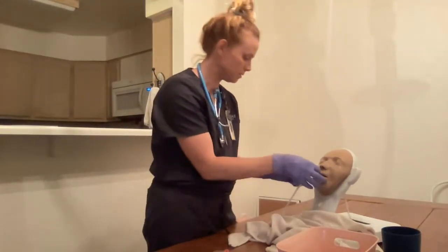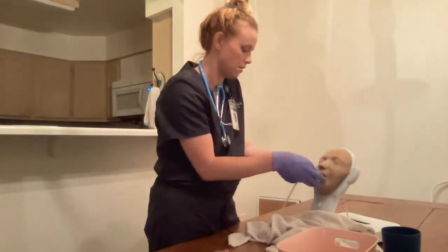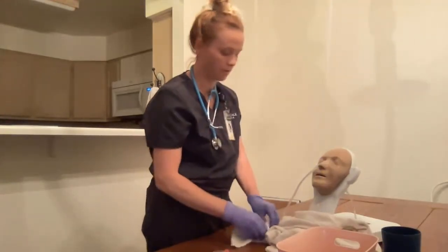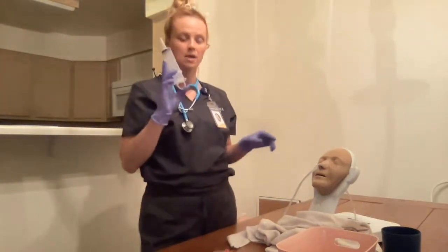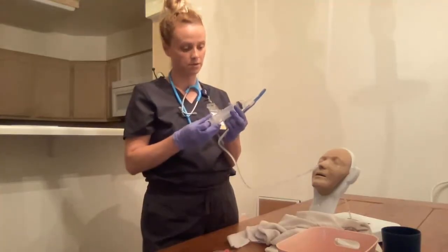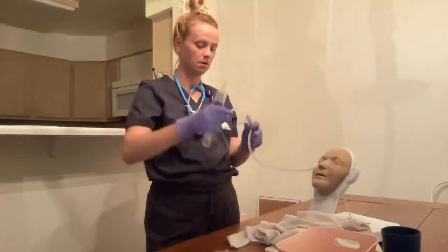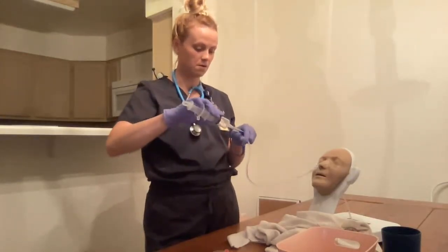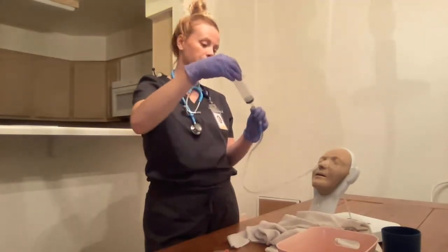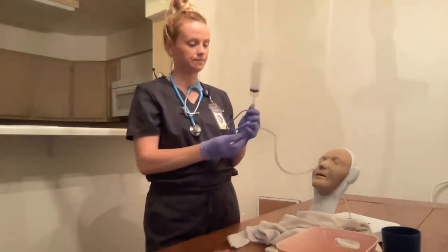All right, I'm going to place a temporary hold. Please take the tubing here just to hold in place while I check the stomach contents. All right, there we go. Next I'm going to get my 60 milliliter syringe. I'm going to pull back 30 milliliters of air. Okay, kink the tubing. Unclamp. Administer the 30 milliliters of air. Unkink. And I want to withdraw back 5 to 10 milliliters of gastric content. Kink again.